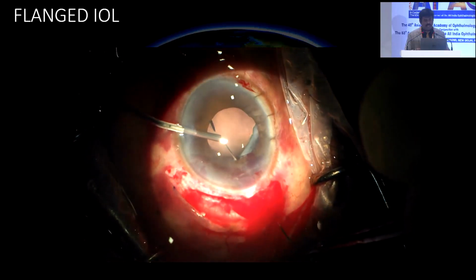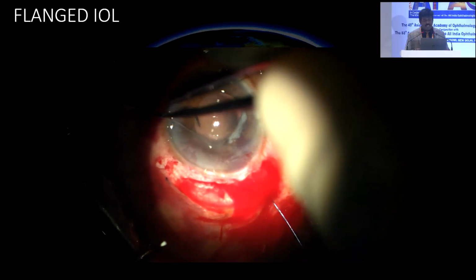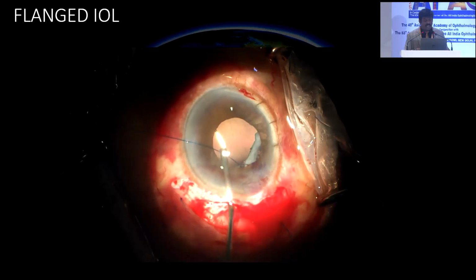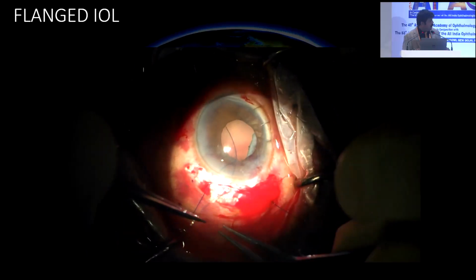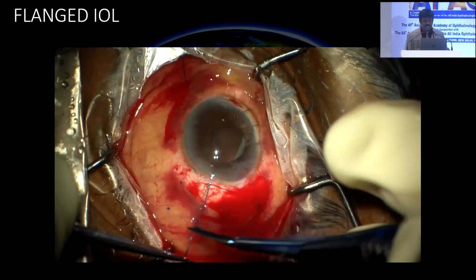And with the other forceps or the beveled cannula over there, insert the needle, try to pull it out through the stab incision. Likewise, on the other side, insert the needle in the cannula and try to pull it out. And you can try to crisscross those sutures over there.